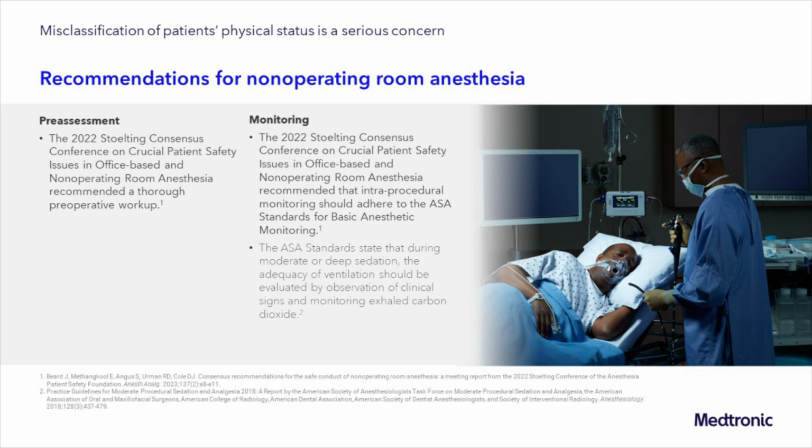Well, according to the 2022 Stoelting Consensus Conference on Crucial Patient Safety Issues in Office-Based and Non-Operating Room Anesthesia, they recommended a thorough preoperative assessment of that ASA classification, in addition to, and I emphasize to those participating in our talk today, that all people should adhere to the ASA standard for basic anesthesia monitoring, which includes the big five, right? The non-invasive pulse oximetry, the non-invasive blood pressure cuff, heart rate, respiratory rate, and end-tidal CO2 monitoring.